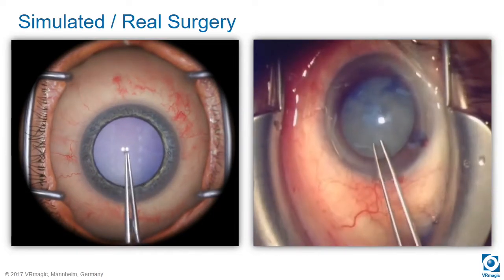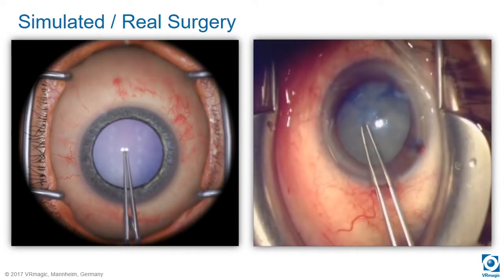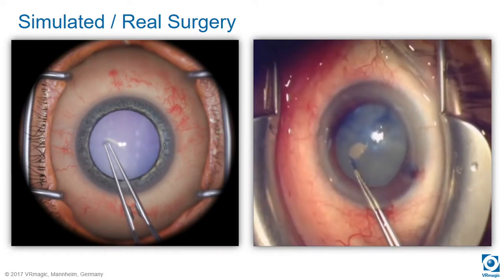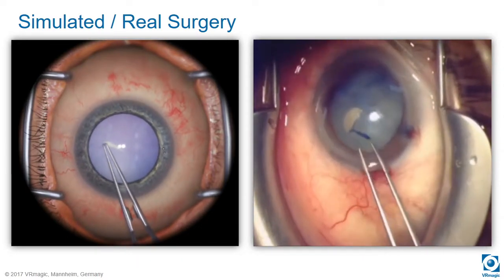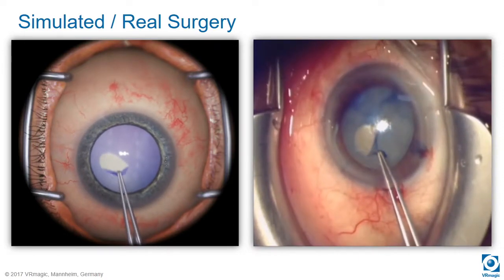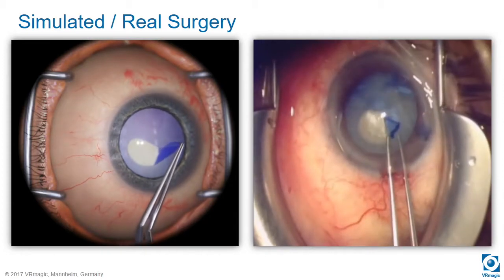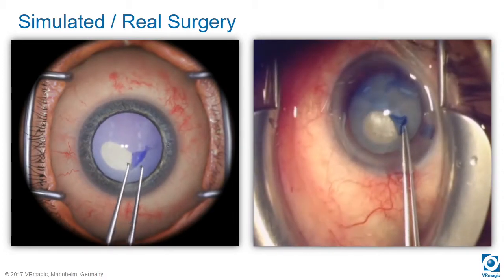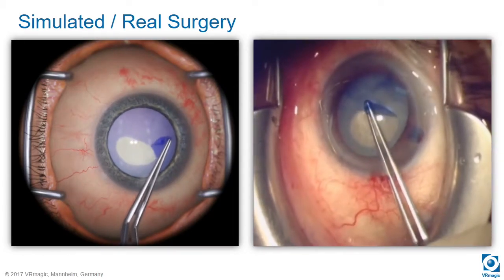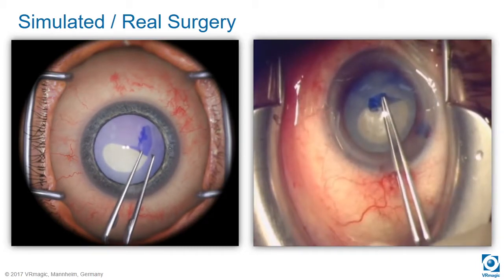On the left, what you see in the stereo microscope. And I'm a bit proud of that. We presented that last year, and it was the first time for me that I had to look twice to see what is reality and what is simulation. You still see that the simulation is a bit cleaner than the reality. The real surgeon is also a bit faster than the trainee here. But the tissue behavior is quite similar in a qualitative way.